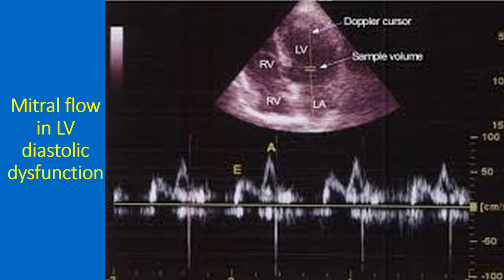The upper half of the image shows the apical 4-chamber view of the heart. The Doppler cursor and sample volume are seen along the midline of the left ventricle. The lower half shows the Doppler flow pattern across the mitral valve, with the X-axis representing time and the Y-axis representing velocity in centimetres per second.